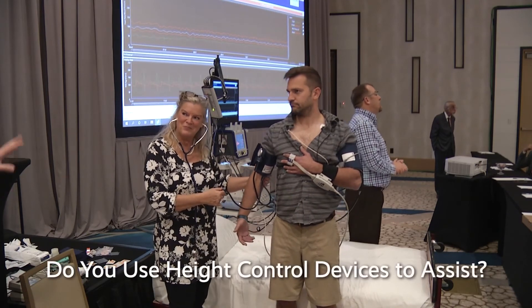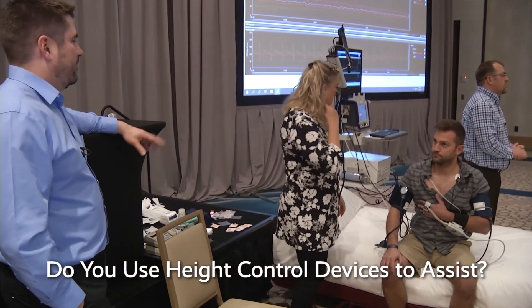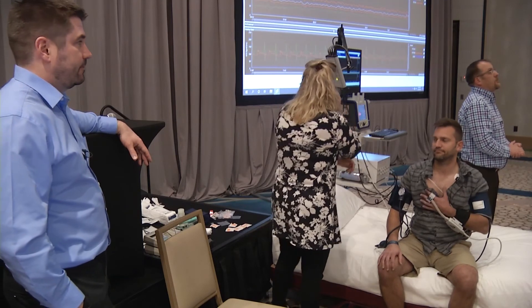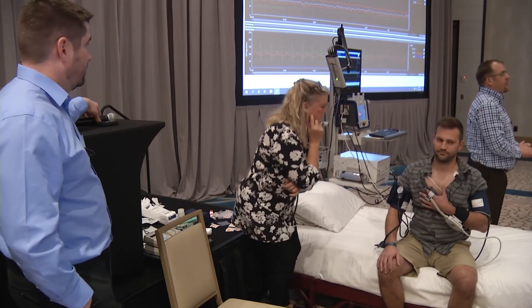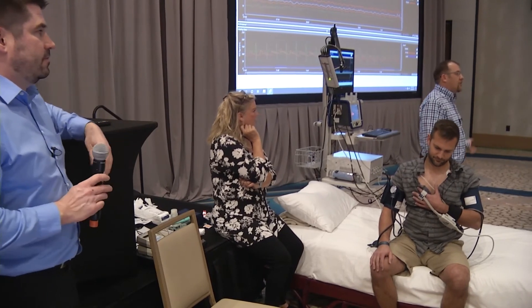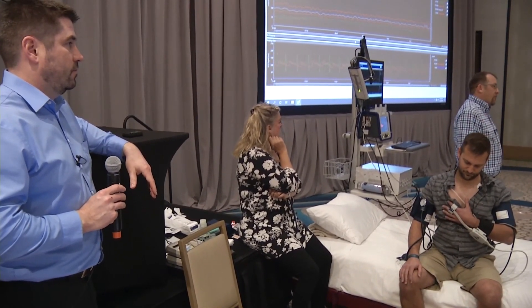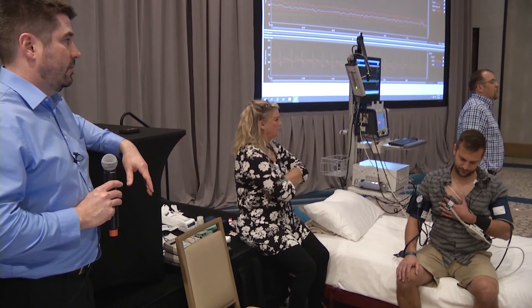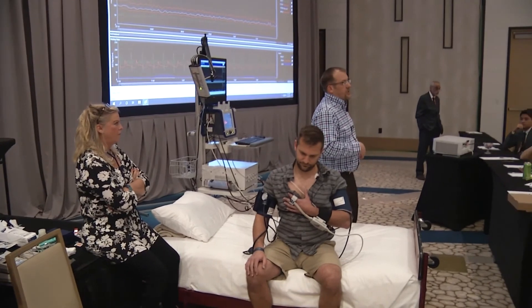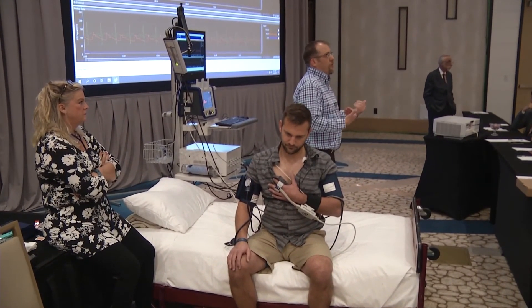Question: Does CNAP have a height correction device, and if not, why not? I can't answer that — that would be a great question for the vendor. For our purposes we keep everything at heart level using an arm sling or arm board with the tilt table, so we don't use the height correction units that come with some other devices.